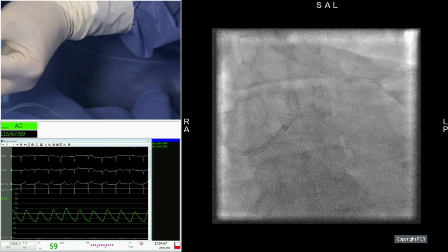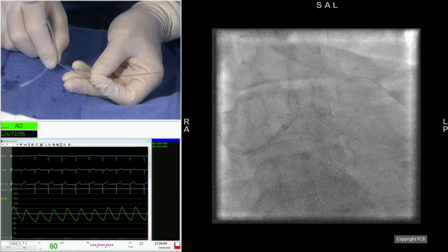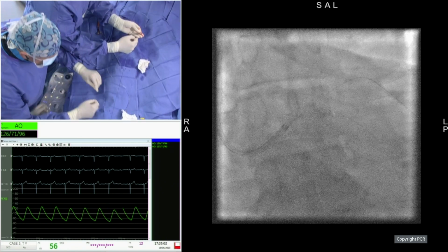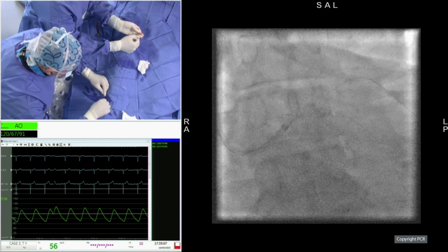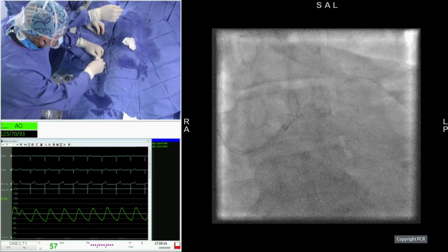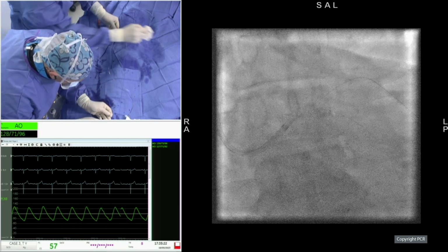No, but I think the tip with wire shaping is, we used to call it double Japanese hook, and I think that's a really nice one for technical detail. Yeah. But you know, in this case, you realize that the wish to go to a distal cell from a proximal cell is quite idyllic, I would say, but not always realistic. So it's here, and they were happy to wire the vessel without being too selective in selecting the cell. I think we are making serious progress now.